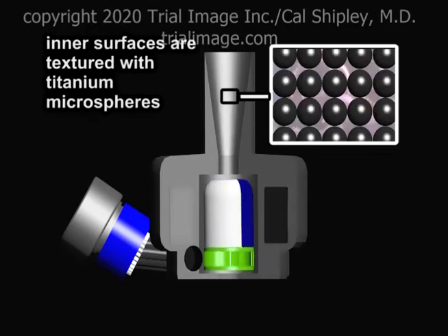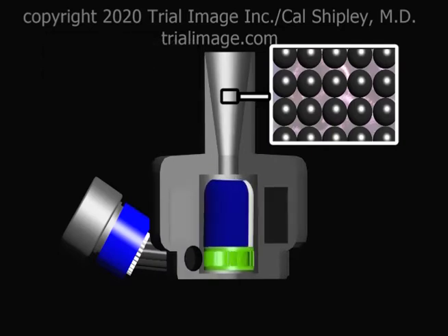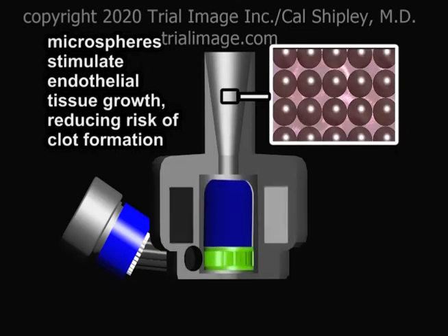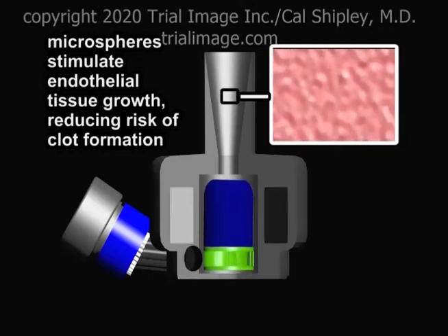In addition, all the inner surfaces of the pump over which blood flows are textured with titanium microspheres. The microspheres stimulate production of endothelial tissue, which coats the surfaces, preventing blood contact with artificial materials, further reducing the chance of clot formation.